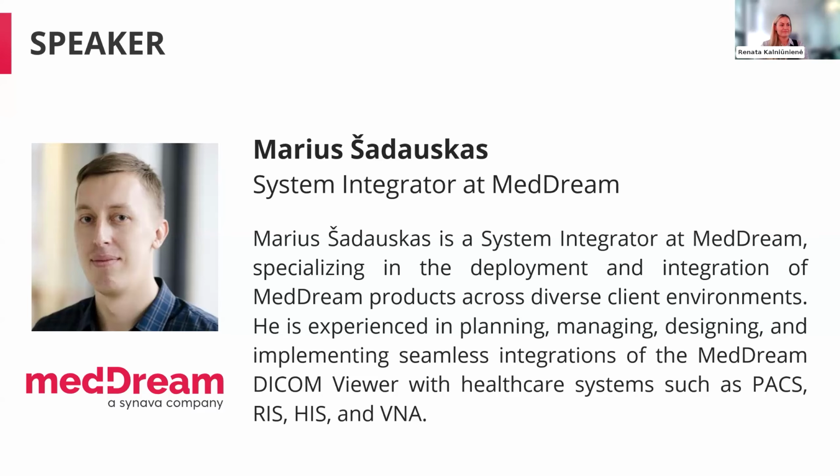On our webinar today, we have ScanFlow, an AI-enabled radiology workflow software company, which delivers hanging protocols across different modalities like MRI, CT, X-ray, ultrasound, and others. In principle, this helps the radiologist save time and open studies in the viewer in a more structured, well-displayed way, without wasting time dragging and dropping all the series to the correct viewports and so on.